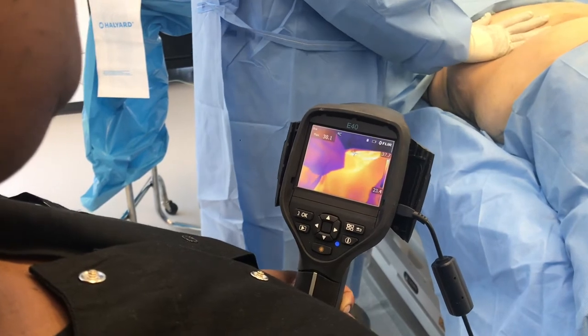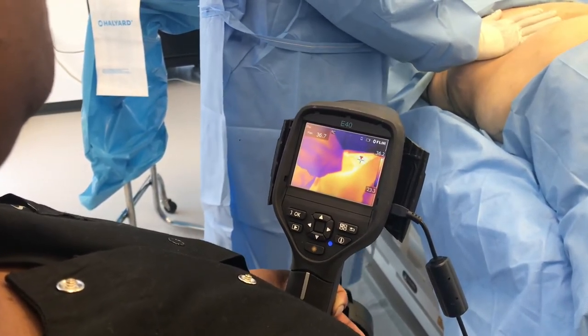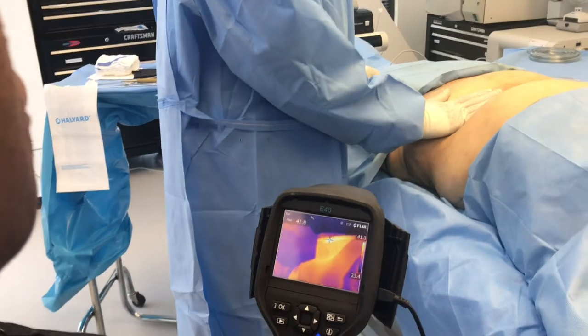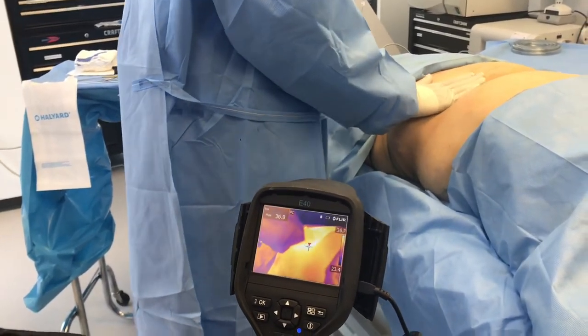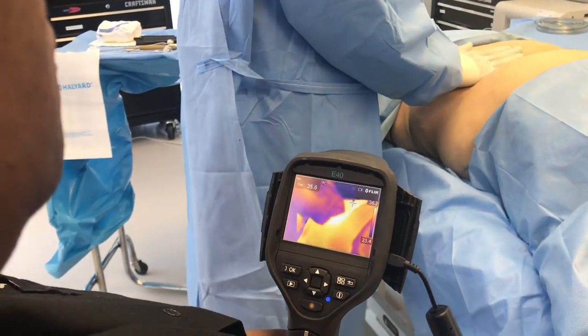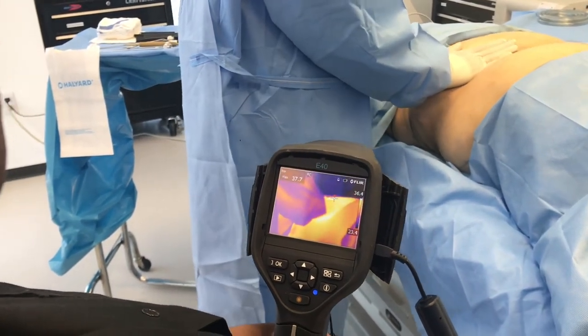The nice thing about this kind of skin tightening is that the skin is at that target temperature for collagen remodeling for several minutes, instead of a microsecond like it might be with certain laser devices or ultrasonic devices. So you're getting a lot more heat being delivered to the area for collagen remodeling in a very safe way that doesn't cause any burning.